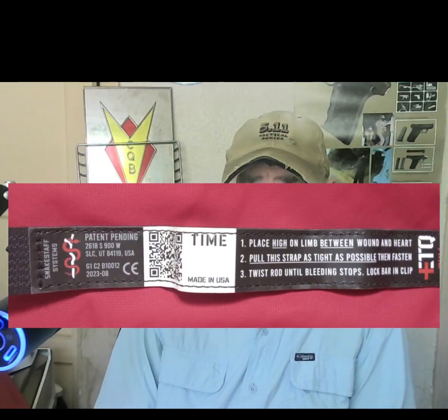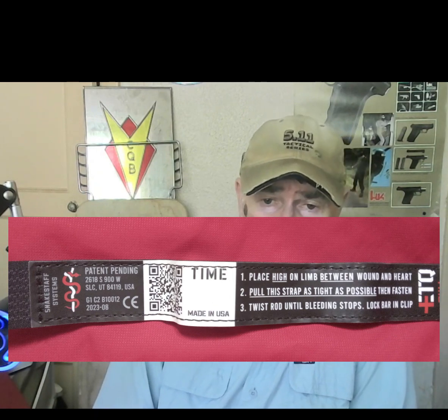There are instructions for use printed on the strap, and this is for any third party who might come across a scene, somebody struggling with a tourniquet, can't apply it for one reason or another, and the instructions are there. There's also a QR code which you can scan using your phone, which takes you to a video. Now, how much time you would have to watch a video while someone's femoral is gushing is another question. However, it's certainly not a disadvantage to have this, and you can always scan the QR code ahead of time and watch the video. In fact, obviously you should be getting as much information as you can.